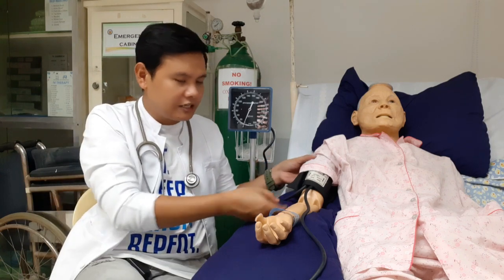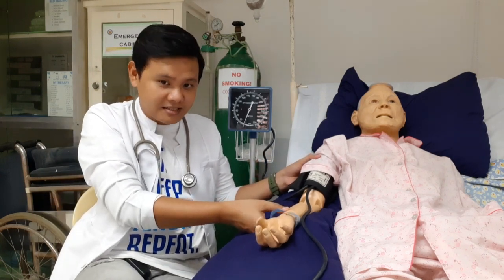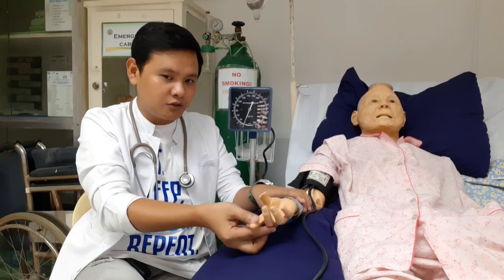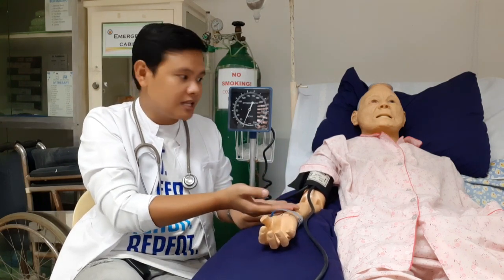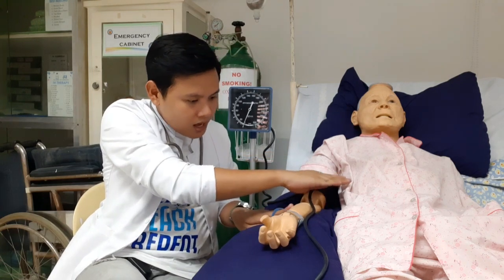Okay? What else? The elbow, as you can see here, the elbow should be slightly flexed with the palm facing upward or facing up. Okay, what else? The forearm is supported at the heart level. As you can see, this is the heart. Ito po yung heart level.